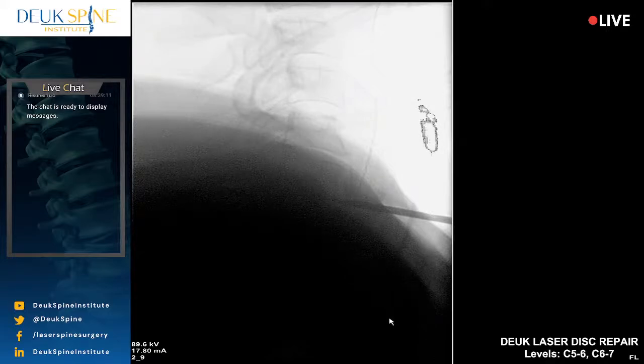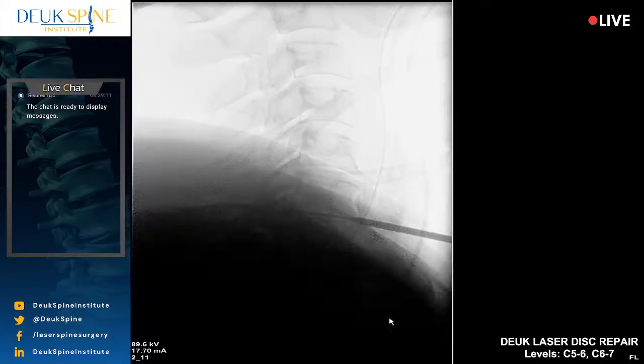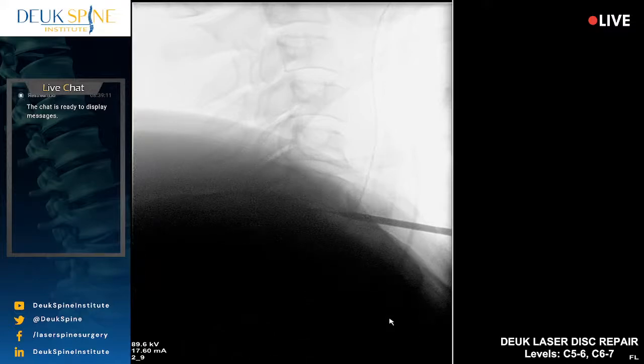And let's see if I can advance this. I will need some help, guys, with the fluoro until I get everything in the final position. Doctor, if you don't mind giving us some inline traction. Ready, doctor? Ready. I'm ready. Shot. That's perfect. Let's relax. Right there, shot. Good. And I'm going to advance this into the disc. As a matter of fact, I'm going to use the mallet to do so.